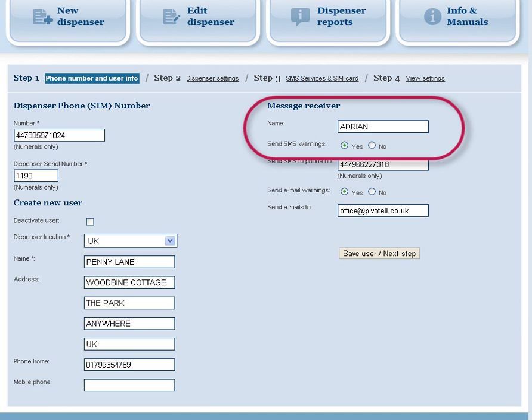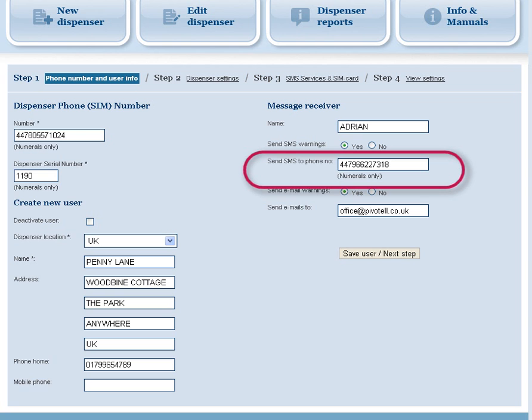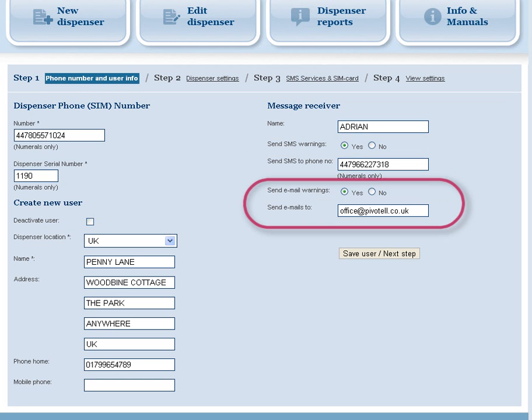Next, enter the name of the person who is to receive the message. Click on the Yes or No fields to activate SMS messaging, and enter the receiving mobile phone number. Be sure to prefix the number with double four and to delete the first zero. Click on the Yes or No fields to activate email messaging, and enter the email address.